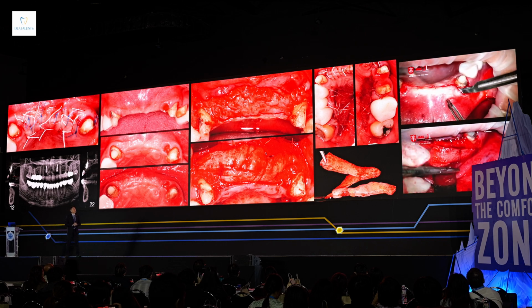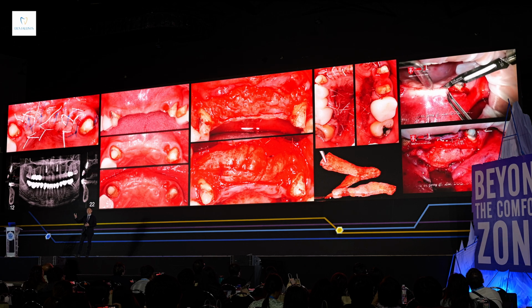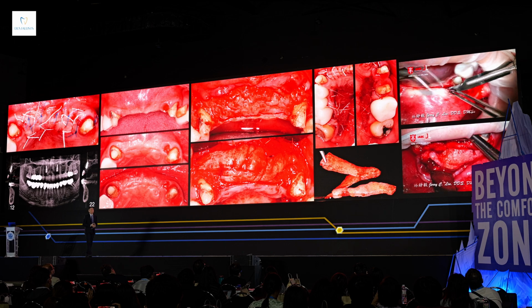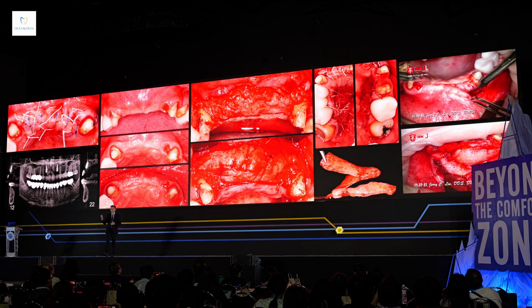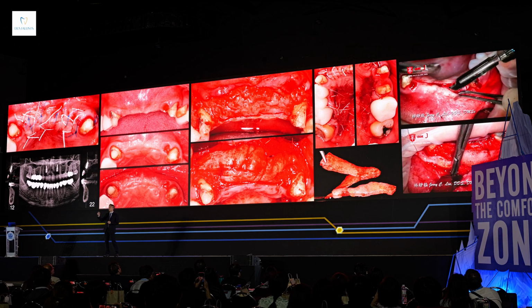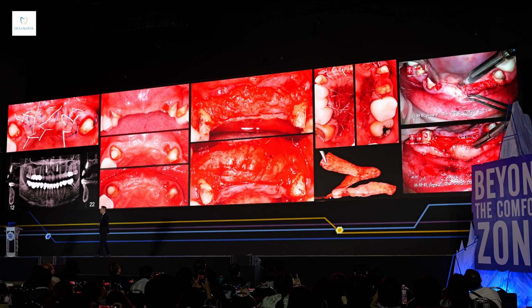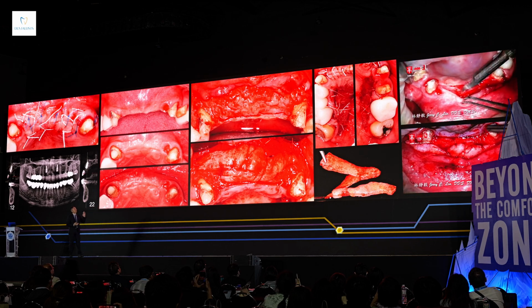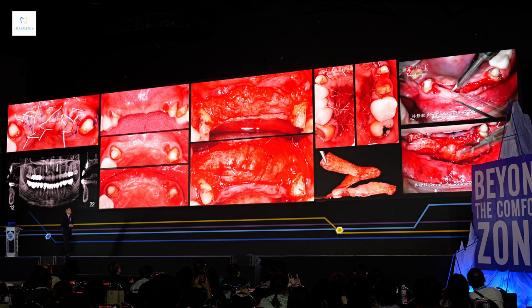And also for the aesthetic zone, it's better to have thicker tissue. There are a lot of articles you can quote. Based on Joseph Kan, 2006, that indicates we don't have enough tissue on the buccal of a natural dentition, on average about 0.6. Then we need more soft tissue. So for this particular case, I did a connective tissue graft. I took the graft from the palate.